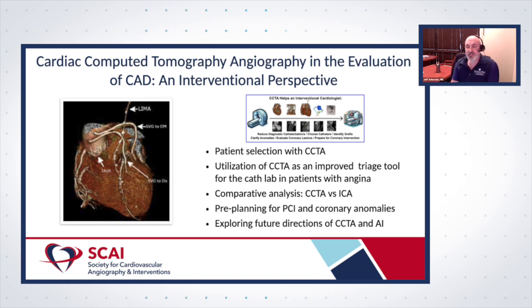I know that a lot of times these days, when someone's coming to the lab with a CT coronary as the reason for going to the lab, I spend a little bit of time looking at the images and making sure I know what I'm going to expect once I'm doing the intervention. So I thought this is a very helpful perspective. It's really focused on how this technology is helping us as interventionalists in the cath lab.